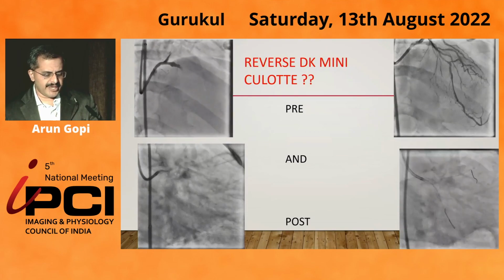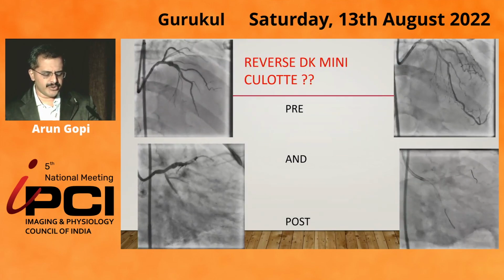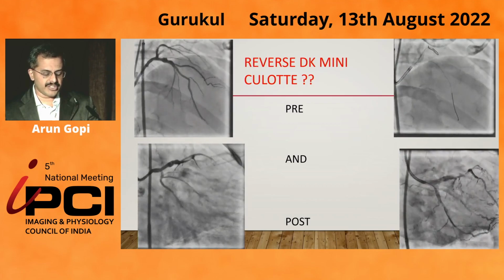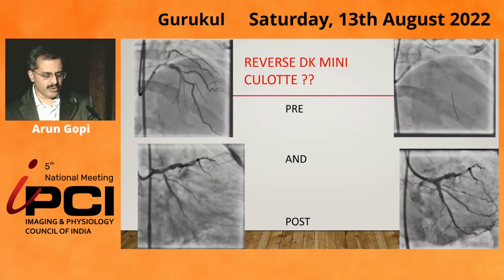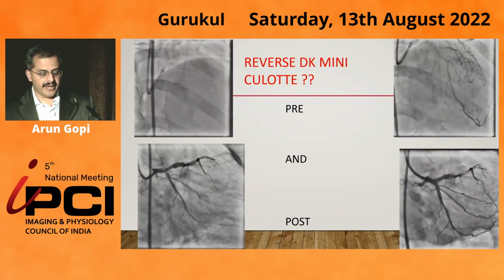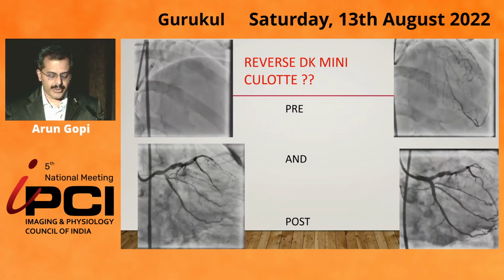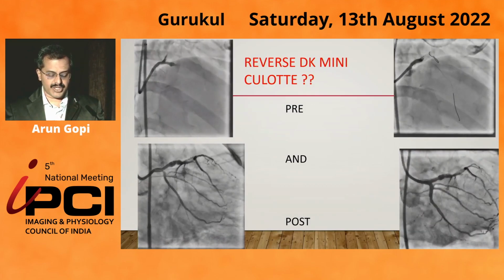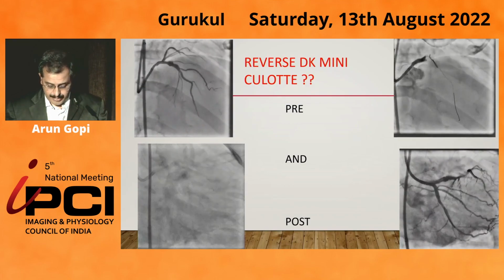What we realized was the aneurysm was at the distal stent edge, probably a hypersensitivity to the polymer, leading on to an aneurysm there and causing late acquired stent malapposition. That aneurysm segment we couldn't appose well even in the final imaging, but the ostium of LAD was adequately prepared and the LCx was rewired, and we did possibly a reverse DK mini-culotte in an initial stented LAD segment.